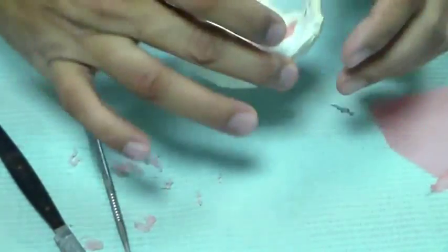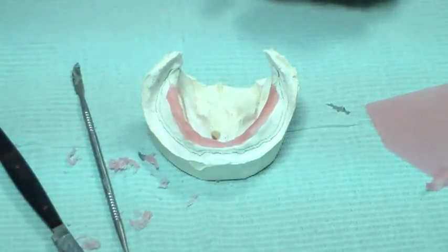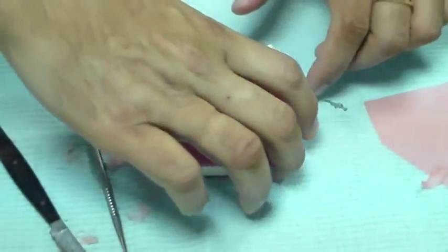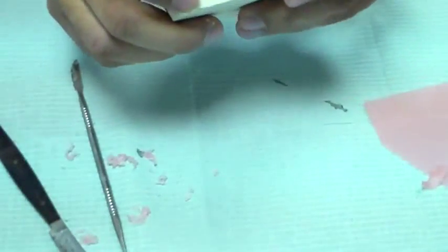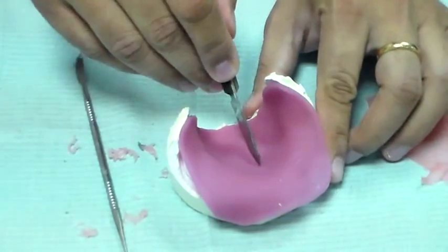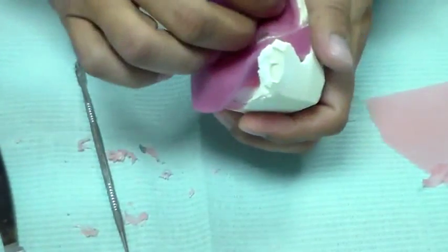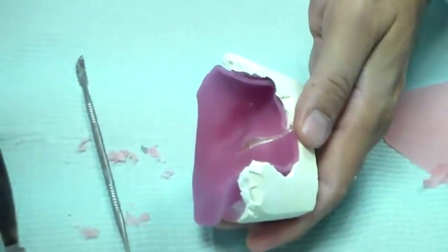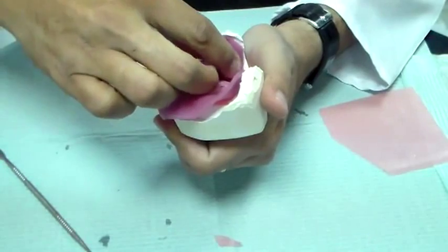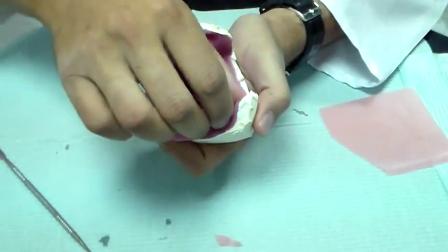Now I want to add my acrylic resin. I'm going to turn off the flame and take my light cure acrylic resin. Obviously there is a lot of space in the posterior part, so the easy way — as taught by most of my teachers — is to just cut a slit in the center. That makes it easier to adapt the material. Having put the slit, I just want to, with my finger, gently press and adapt the material onto the cast. You don't want to stretch the material, you just want to adapt it.